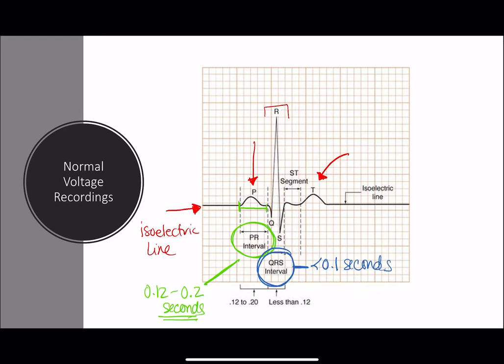If there is something that has changed the shape of the QRS or widened it and made it take longer, that would suggest that the electrical activity is not following those super highways of the Purkinje fibers. It's going through some other path to get through the ventricle. If it's flying through the Purkinje fibers, you should expect an extremely narrow QRS interval.